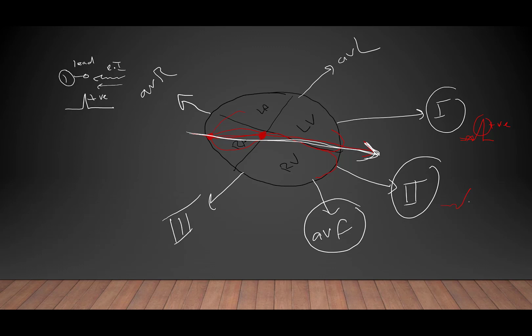It causes a positive deflection. Okay, all of them are positive deflection. Here we have the second point.